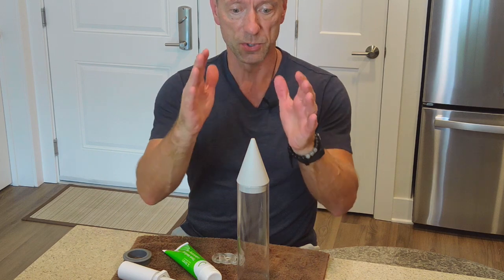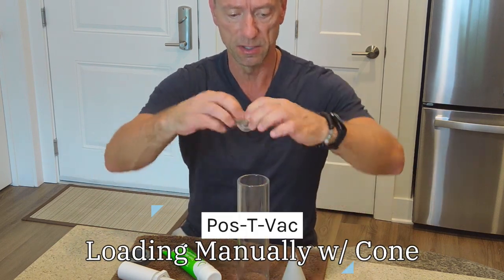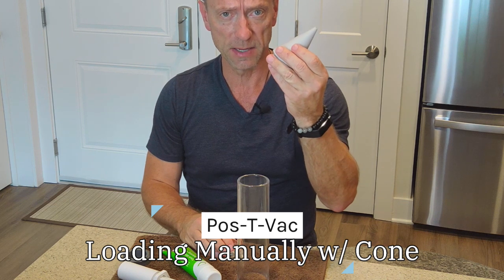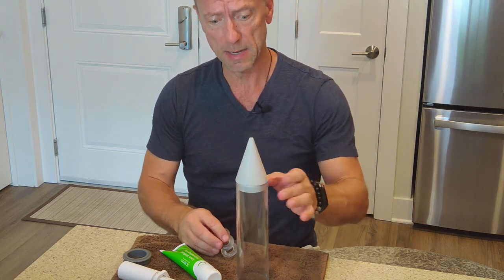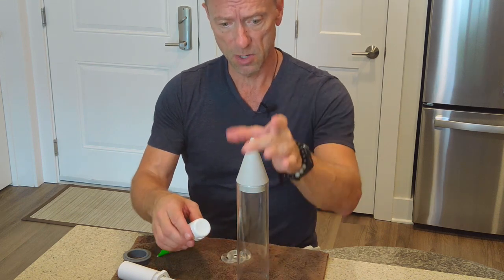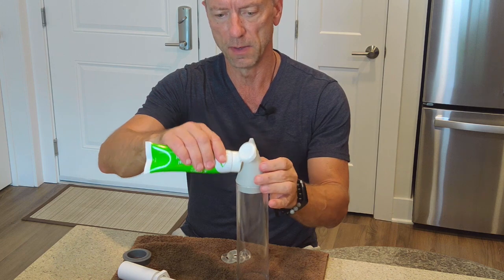If you would prefer to use the cone rather than just manually loading this tension ring onto the cylinder, these come automatically with the Pos-T-Vac system. So what I'm going to do is put this on the end of the cylinder. So once I've got the cone in, I've got to use ample lubricant here. So I just want to load up the cone.